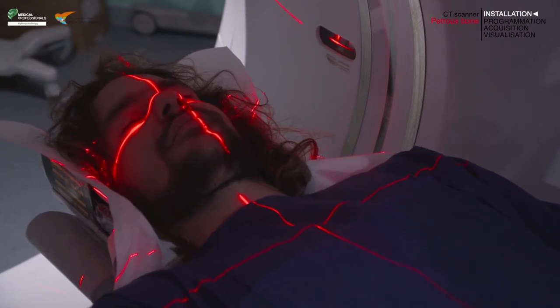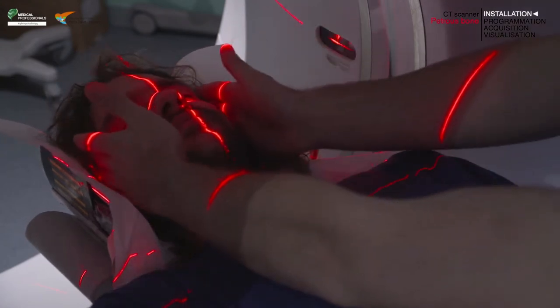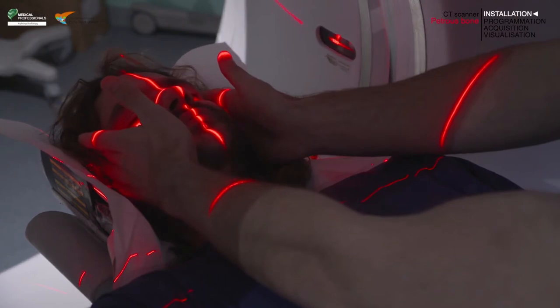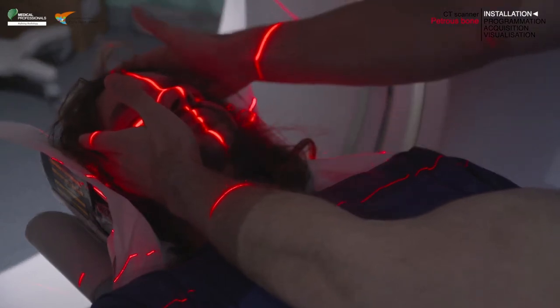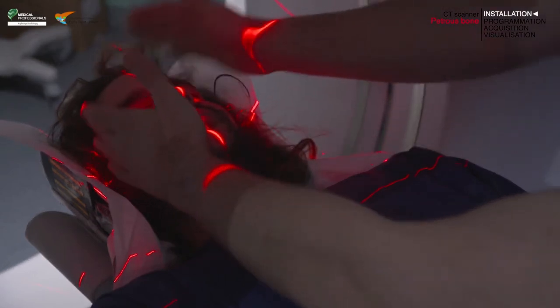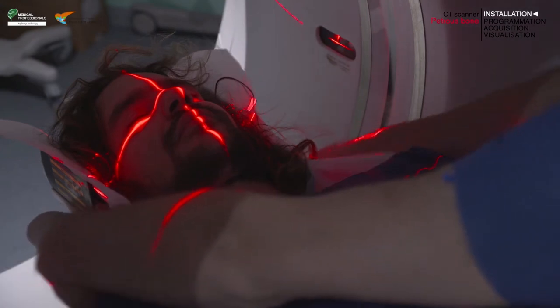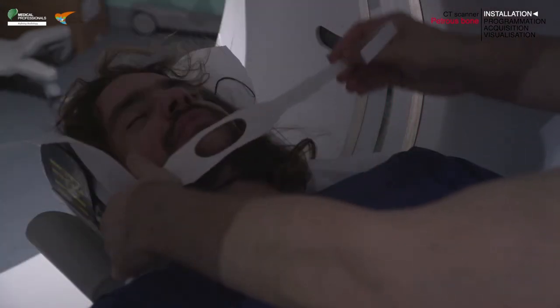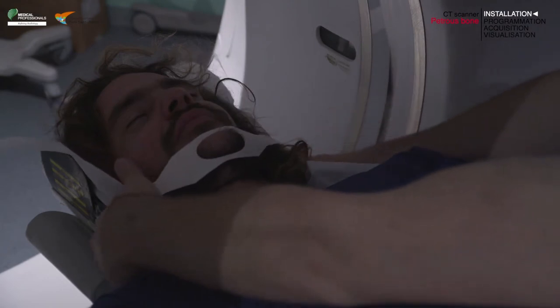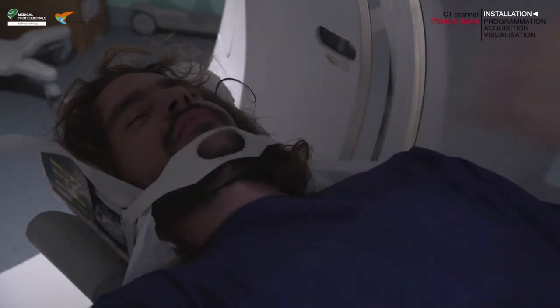This will limit the exposure of the lens of the eye. Make sure that the axial laser light is at the midpoint of the skull and that the longitudinal laser light is placed on the median sagittal plane. To help the patient maintain the position, you can place a restraint strap on their chin or on their forehead.